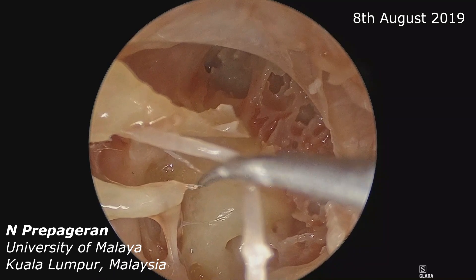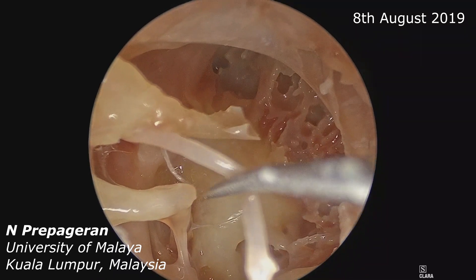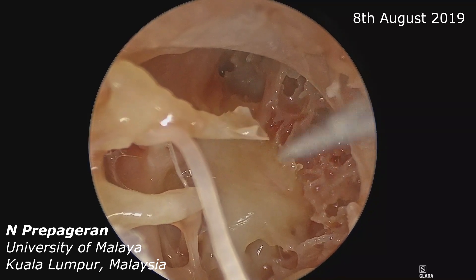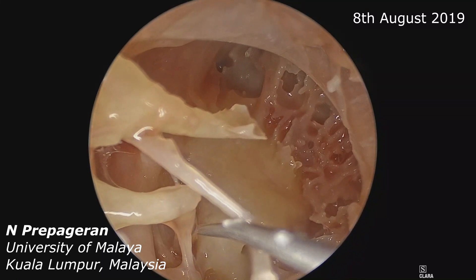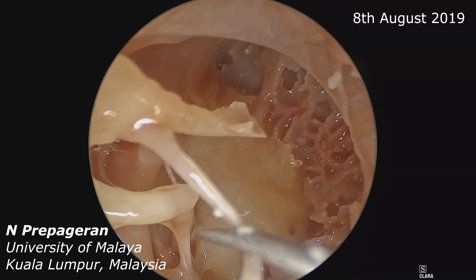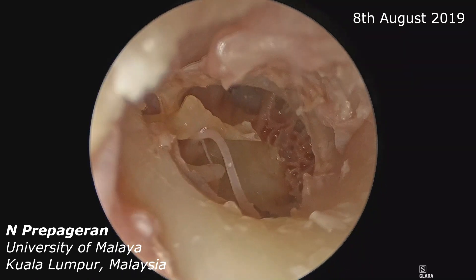Let us slowly push away the chorda tympani. Now you can see the stapedius tendon — and that's the pyramid. You can see the entire footplate now, and the movement of the footplate and how the incus is moving to the footplate. That is the footplate, the posterior crus, the anterior crus, and the incudostapedial joint.